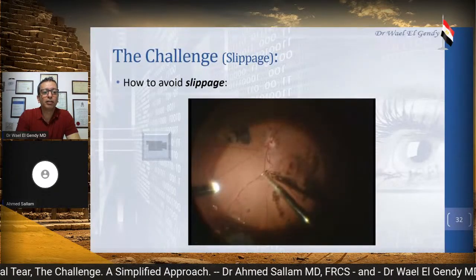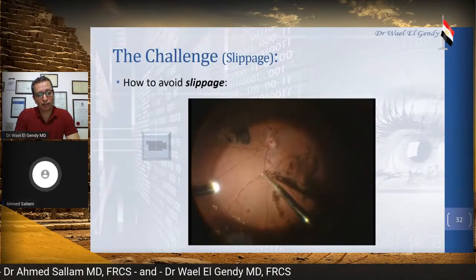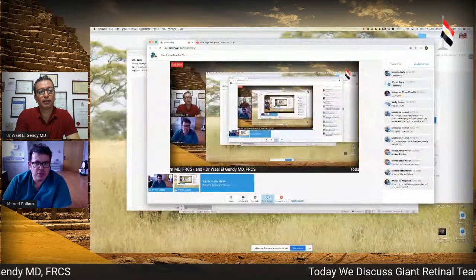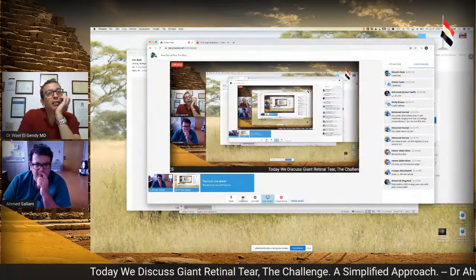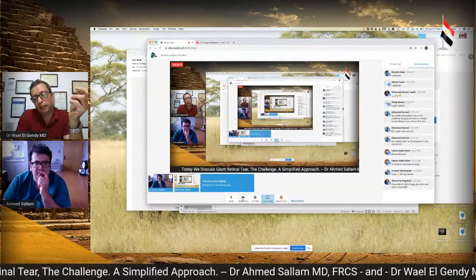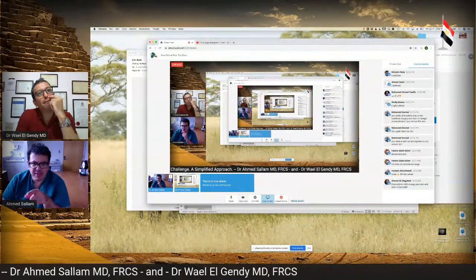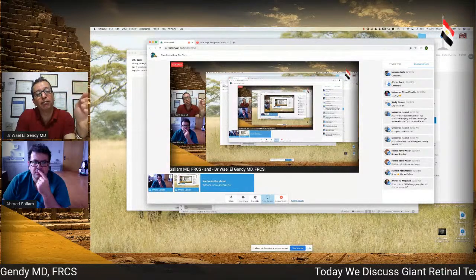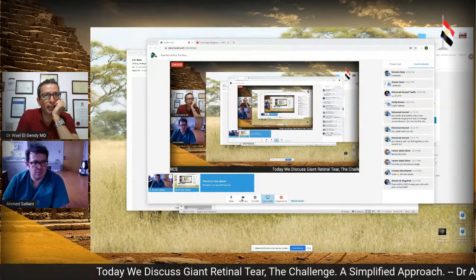That's a very nice exchange. Dr. Ahmed, do you have your video ready? Yes. So let's talk about the passive exchange. So, Wael, how did you do this passive exchange? This is passive, right? This is passive with the flute needle. With the flute needle, okay. So 23 gauge. I'm relying on the pressure of the silicone to extrude the PFC.